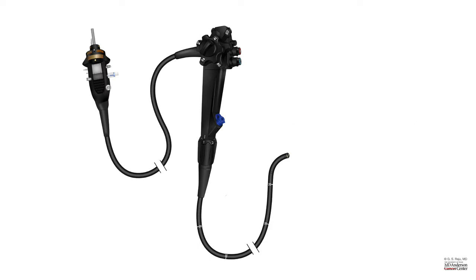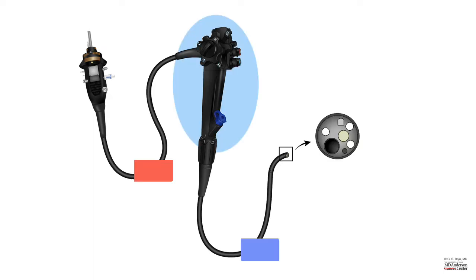So here is a typical endoscope. Here I have taken the example of a colonoscope with the variable stiffness function. Let us look at different parts of an endoscope. Control section, that's where you control the endoscope function. Umbilical cord that attaches to the processor, which provides light and also has hookups to air, suction, water. Insertion tube that actually goes into the patient.